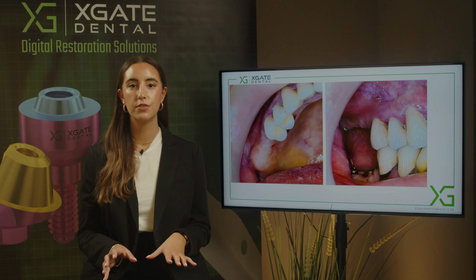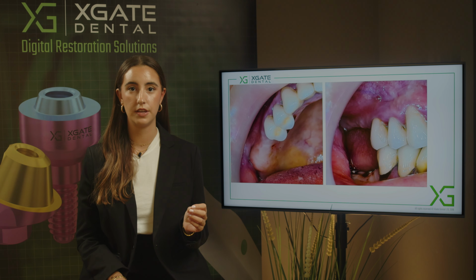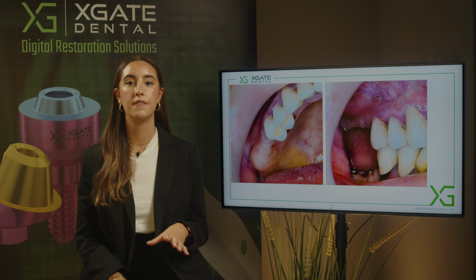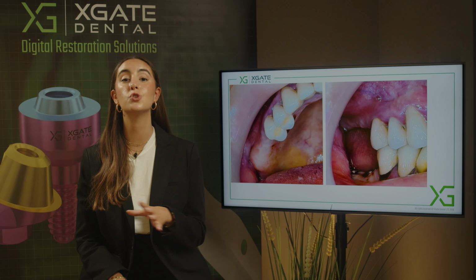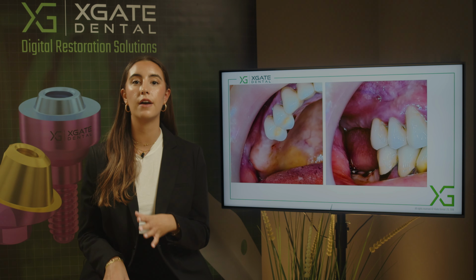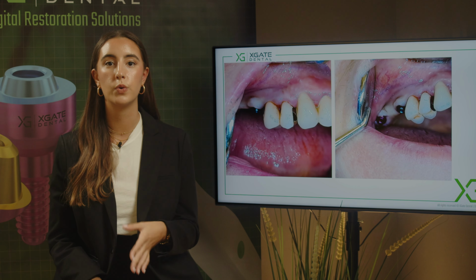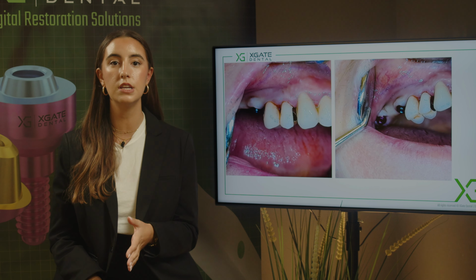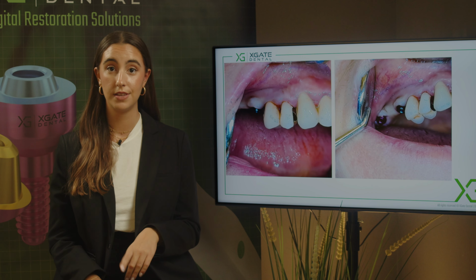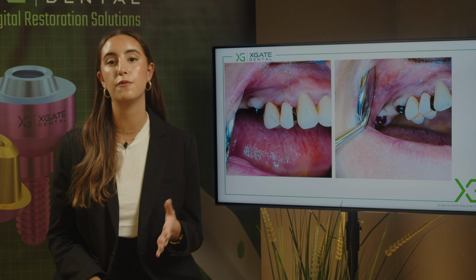You can see here the tooth with the inflammation, and you can see here the fistula. In the future, we'll cut between the 13th and 14th tooth. In there, you can see the place where we place two implants. You don't see it on the CT, but in this case, you have enough bone, enough thickness. We have two implants. We cut the bridge between 13 and 14, and we extract the tooth with the pontic and with the crown already, everything at once. So in this case, the implant that we'll place will be instead of 14.